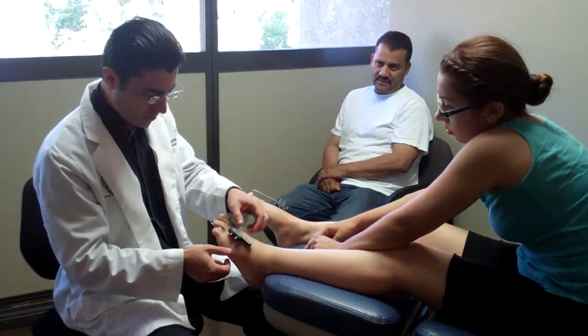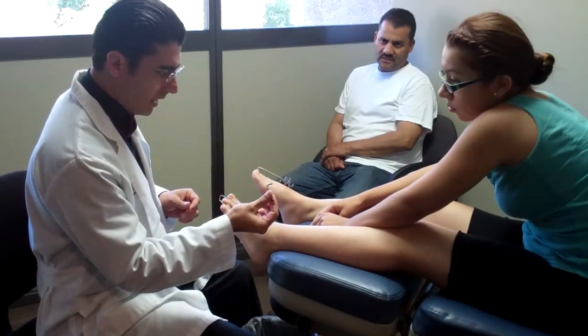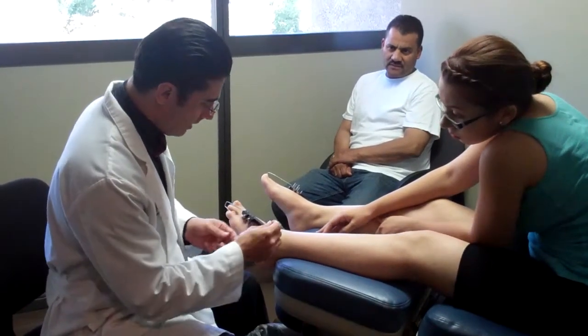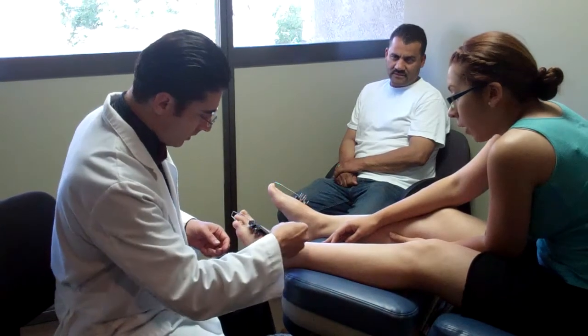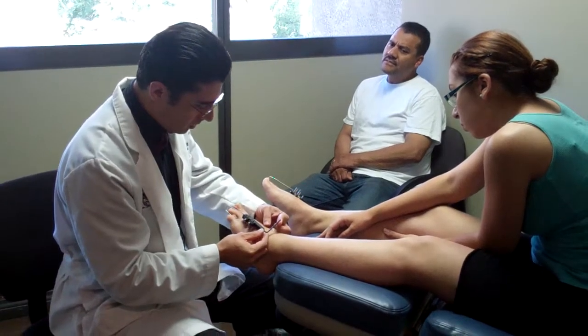Okay, so we're doing your first turn today. What you do is you grab this and I would probably put the short end in because it's easier. You always want to go this way. So you push this in and when it locks in, you do your turn.